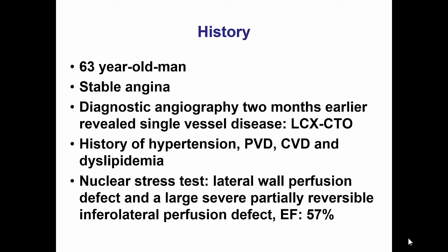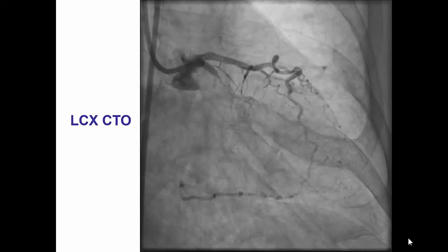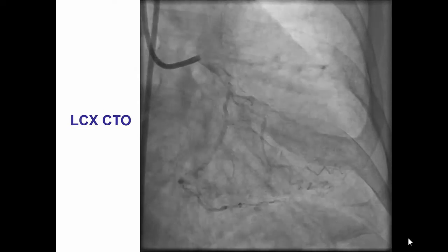This was a case of a 63-year-old man with stable angina and a circumflex CTO, and ischemia in the corresponding myocardial territory, who had refractory angina despite medical therapy. He was referred for PCI of the circumflex CTO.